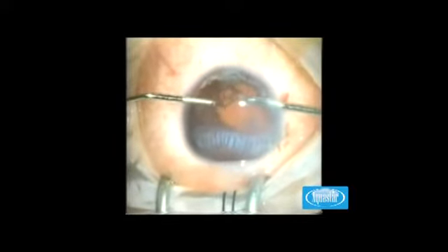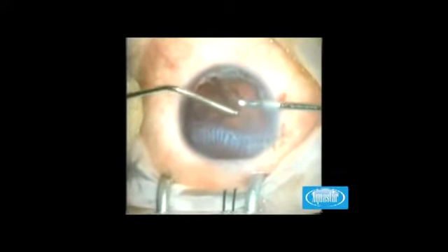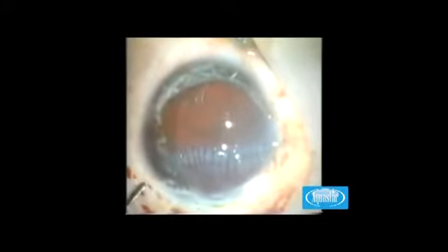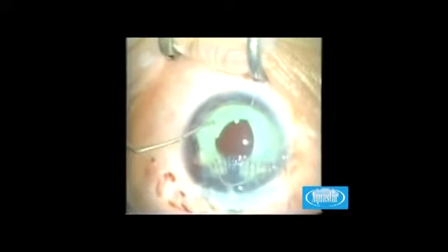A severe perforating injury involving the cornea, iris and lens can be seen here. After appropriate treatment of the cornea and lens in the form of corneal oversewing and phacoaspiration, the traumatic iris injury is compensated primarily by the creation of an artificial pupil with intraocular lens implantation and the implantation of a capsular bag tension ring. In this case, an IPS double element is combined with a single element. The composition of the implants was selected because the state of the upper capsular bag circumference could not be controlled visually due to the injury, and a C-shaped haptic seemed to be the better choice.